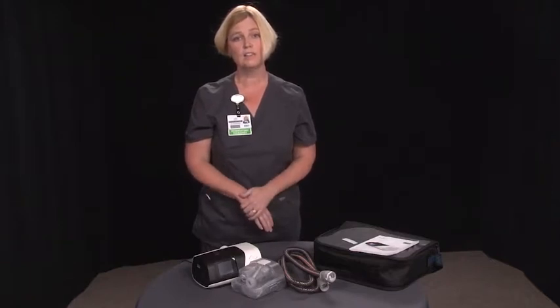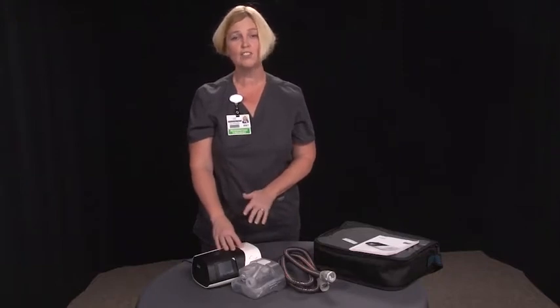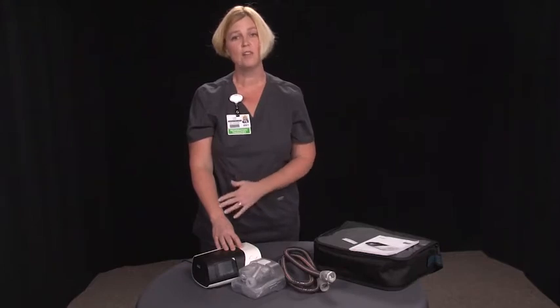Cleaning your supplies is not cumbersome. We do not recommend that you use the ozone cleaning machines that you see on television, as those can actually cause damage to your CPAP machine. Soap and water is a lot cheaper, and it's still the most reliable way to clean your equipment.